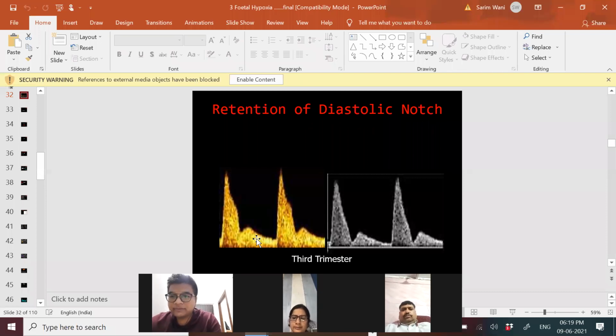Diastolic. Very good. So coming back to your first point of the question, you told me increase. Why? Because it is feeding in your mind that the resistive index is nothing but the S by D ratio. So whenever you read somewhere that there is a high resistive index, it does not mean that the diastolic flow is increased. It actually means that this is due to low diastolic flow. Have you got the point?